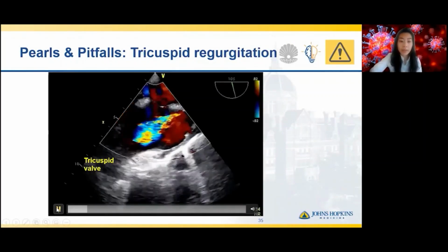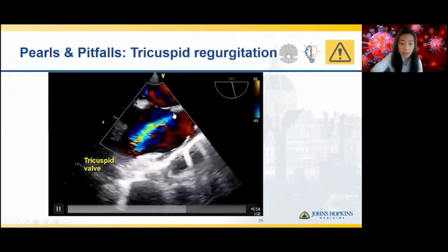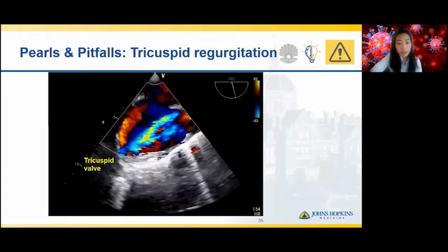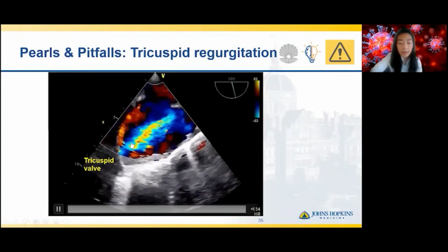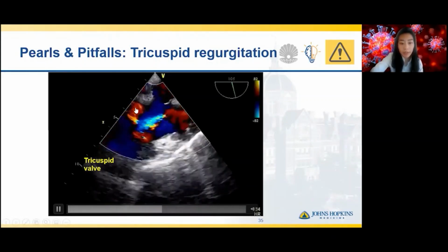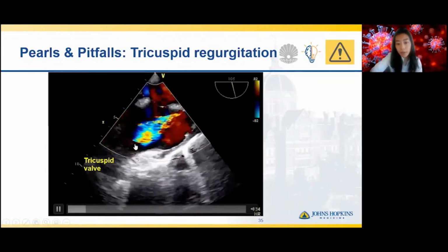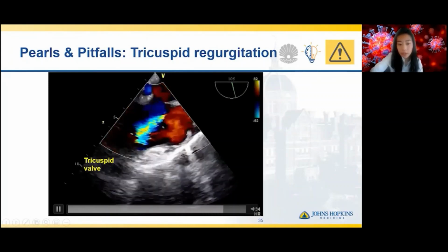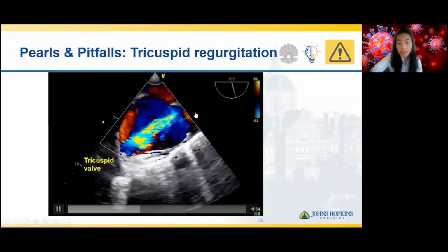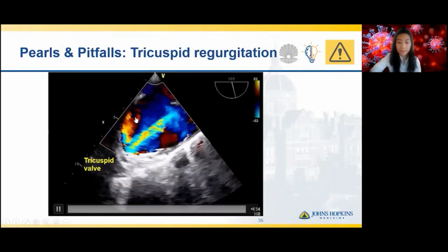Here we have an echo clip that again shows an outflow jet originating in the right atrium coming towards the tricuspid valve, but with this patient's hyperdynamic circulation positioned such that we see a lot of this color flow, I hope you can appreciate, swirling back around the right atrium, representing tricuspid regurgitation. And so this is probably a catheter that we would want to reposition. And usually what we would do is withdraw this a couple centimeters so that it originates a little bit higher in the right atrium and hope to minimize some of this TR.